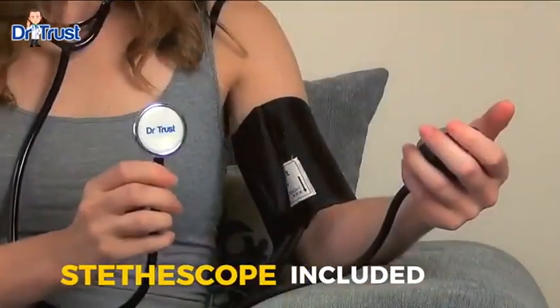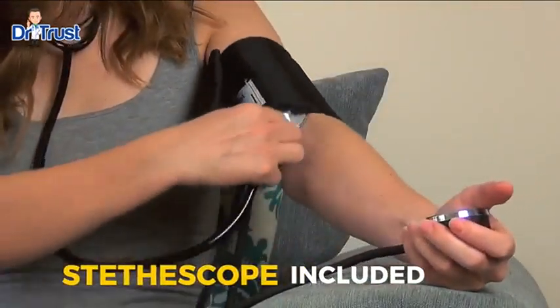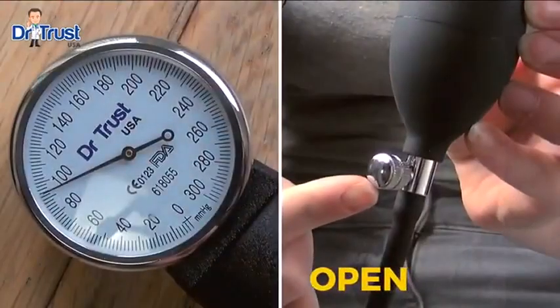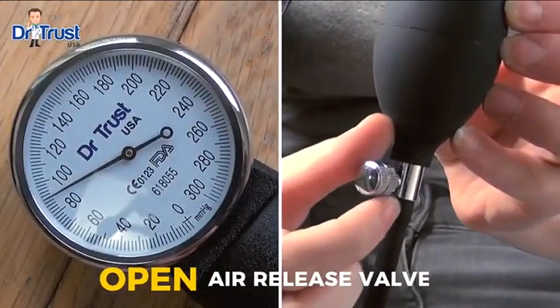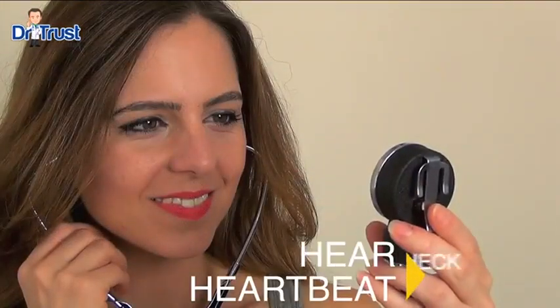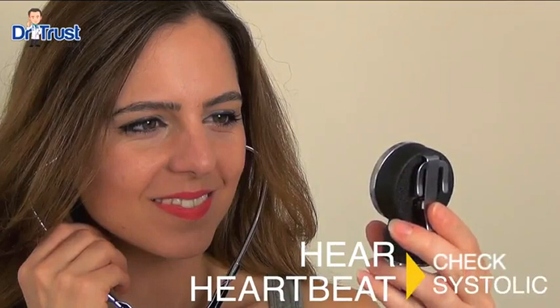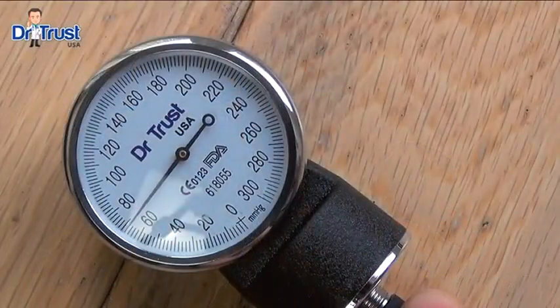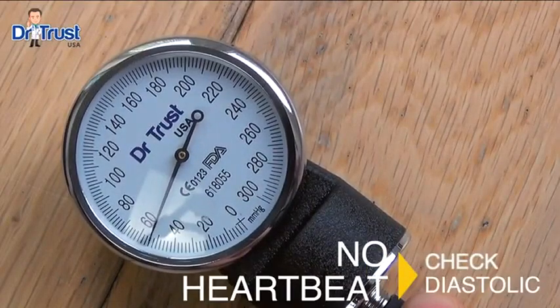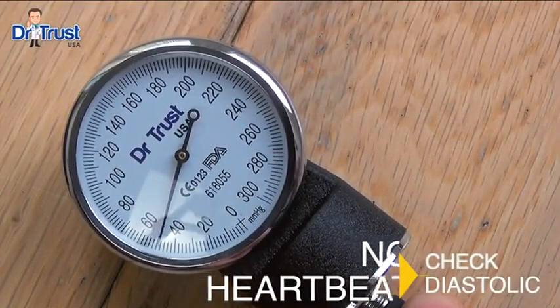When the cuff is inflated, place the stethoscope on the brachial artery and listen for your heartbeat. Open the air release valve a little to allow the cuff to deflate at a steady rate, and when you hear your heartbeat, check the pressure reading for your systolic upper blood pressure value. Continue the steady deflation. When you no longer hear a heartbeat, check the reading for your diastolic lower blood pressure value.